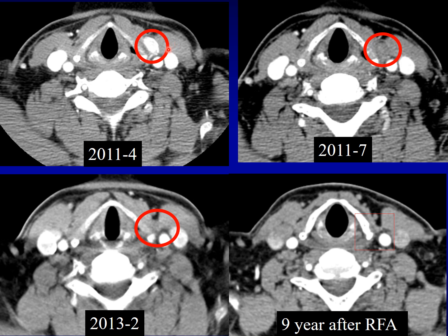CT scan shows intense enhancement of the tumor. After radiofrequency ablation, enhancement decreased, decreased more, and completely disappeared. There was no recurrence at a 9-year follow-up.